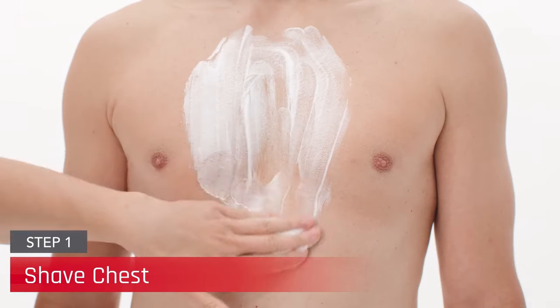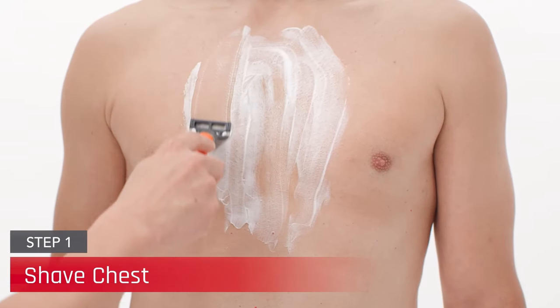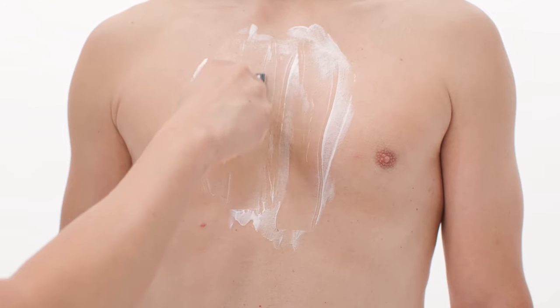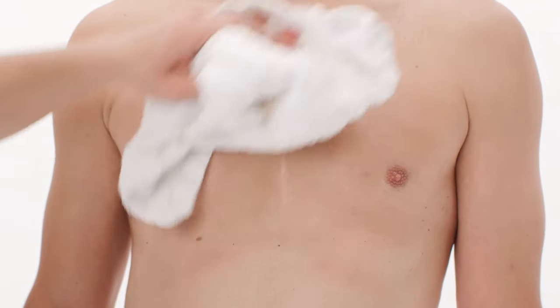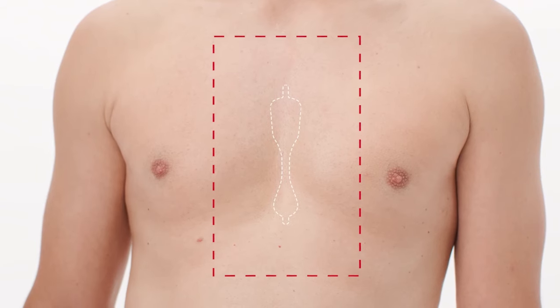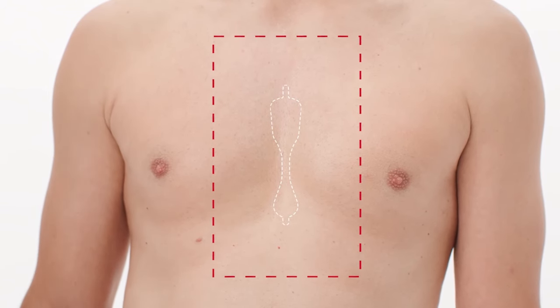Begin by removing all hair over the sternal area by shaving close to the skin. Refrain from merely clipping hair and use a razor to ensure better and complete hair removal. This skin preparation area should extend at least 2 inches past where the CAM patch will be applied.